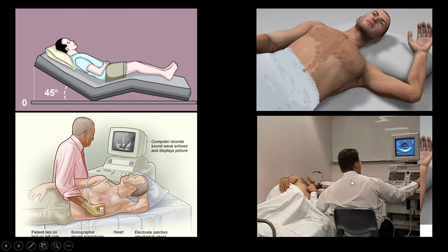The common technique for scanning of the heart in transthoracic is left hand, where we sit on the left in front of the patient and we scan with the left hand. I want to emphasize one important thing as a tech. If you are working as a tech 8 hours, 5 days a week, always try to get a comfortable position and an ergonomic chair that helps you, so your shoulder, neck, and back are in the neutral position.